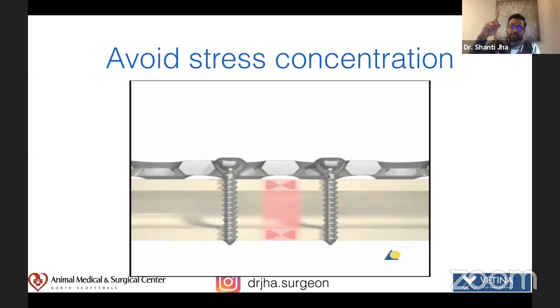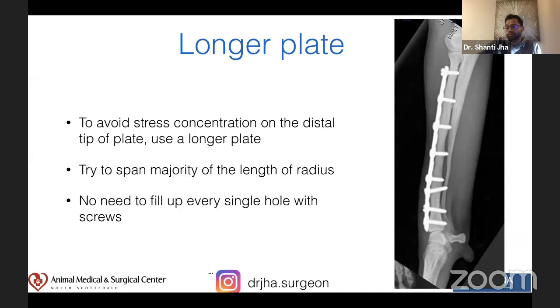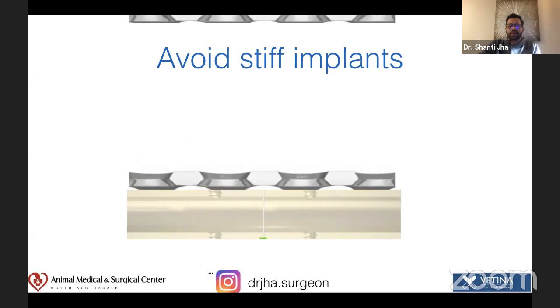Longer plate system, please try to use a longer plate system. There's no need to fill every single hole. If you're using a locking plate system, there should be only four cortices up and four down. I normally still use six and six, even with a normal plate. Stiff implants must be avoided.